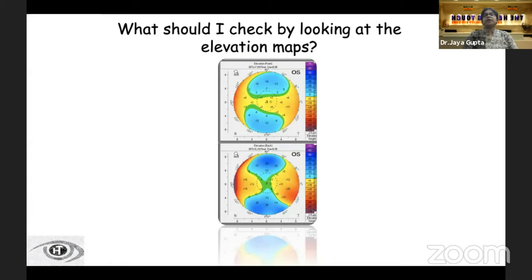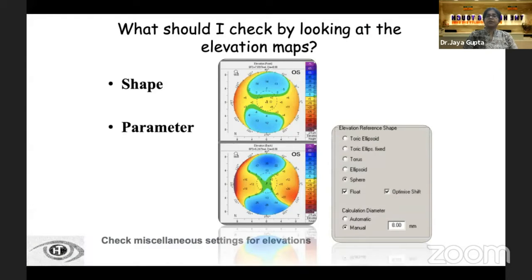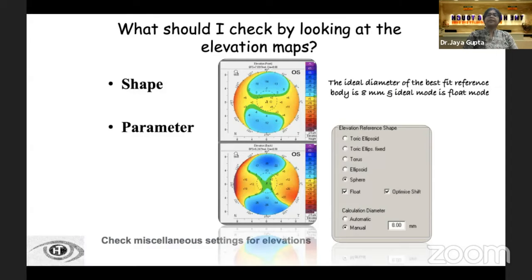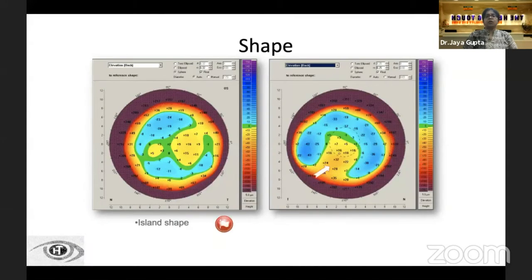When looking at the elevation maps, first check the miscellaneous settings for elevations. The ideal diameter of the best-fit reference body is 8 mm, and the ideal mode is the float mode. In the elevation map, a symmetrical sandy watch or hourglass saddle pattern is normal. If we see a tongue or island shape, that is a red flag.